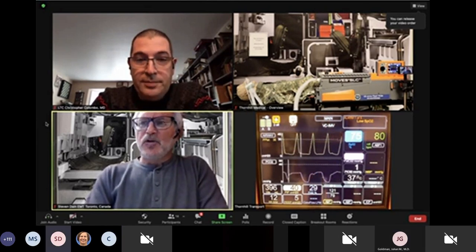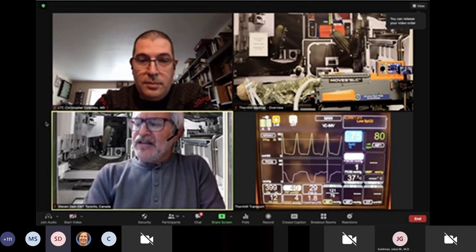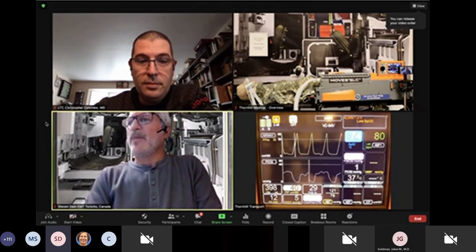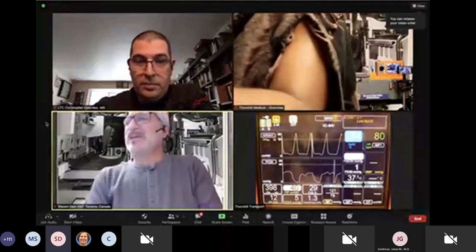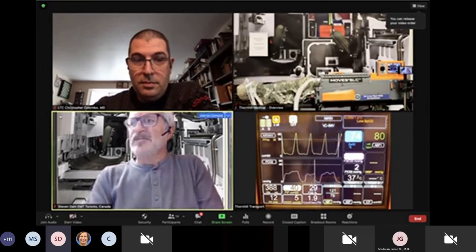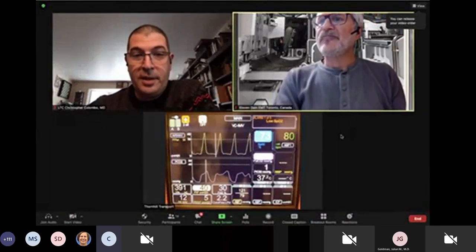I have a 70-year-old woman here on a Thornhill Medical Moves SLC integrated life support system that also has an oxygen concentrator built into it. The patient's blood oxygen level has dropped to 77%, and I need some help. I'm not familiar with this device. It's now 74%. Wondering if you could give us a hand in responding to the situation. Absolutely. I see that SAT dropping in the consult on the Omnicare app.